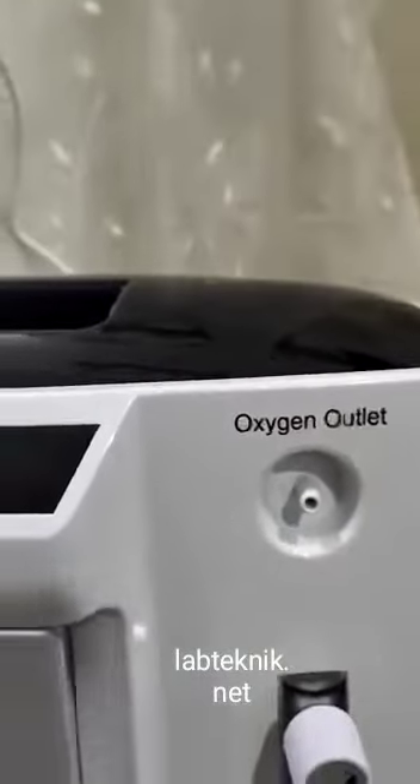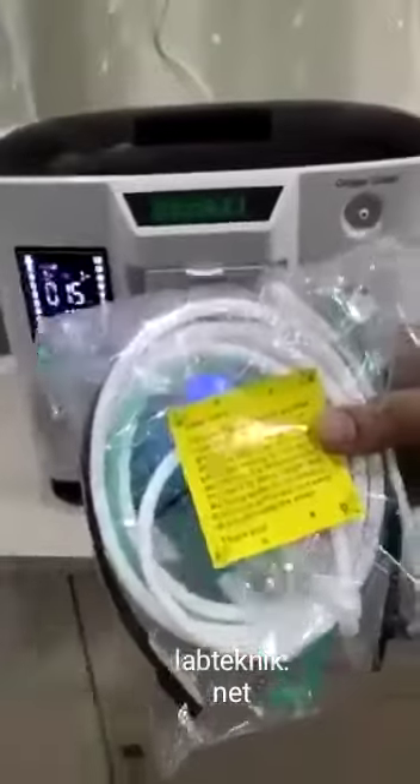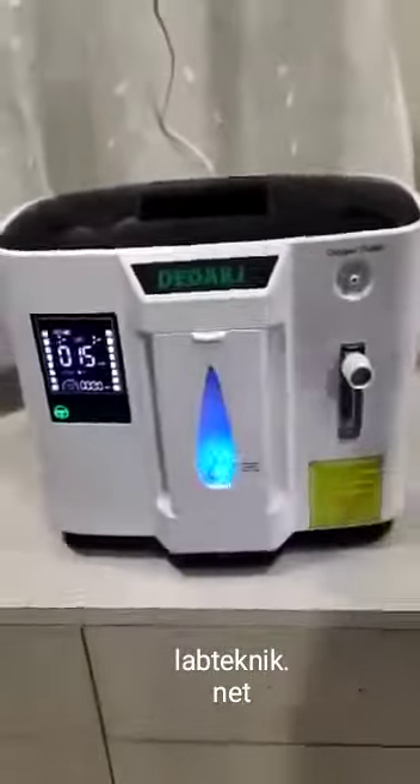We need to use this tube. Insert this tube here and use it. It is a very simple machine to use. And that is it. Thank you.